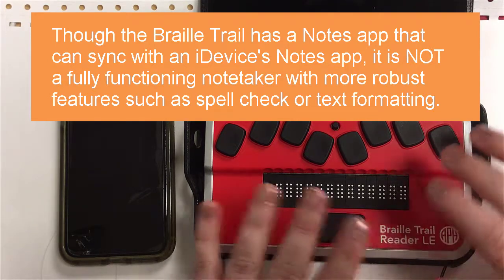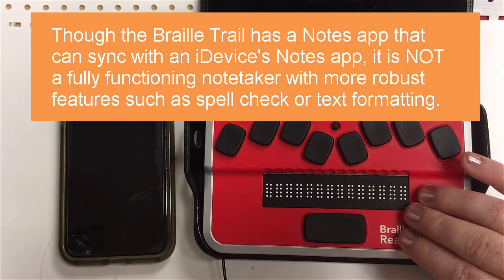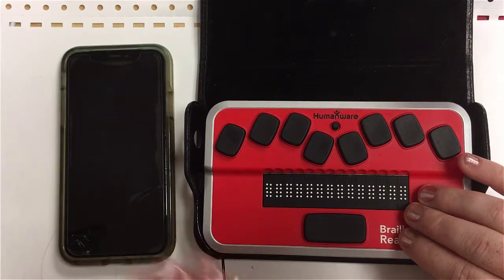We're talking about how to pair your phone with your BrailleTrail, not about the notes syncing feature.